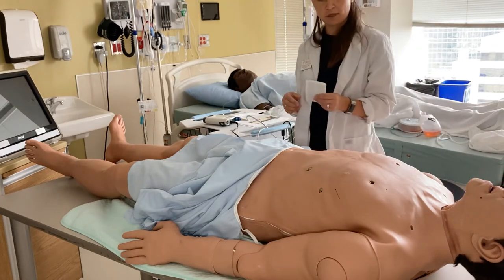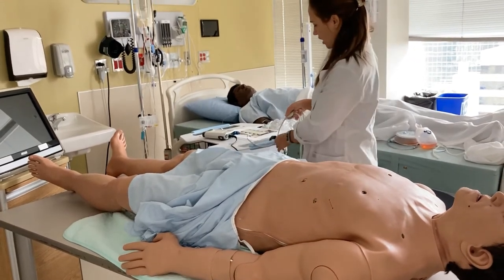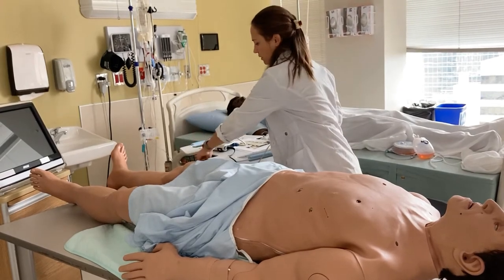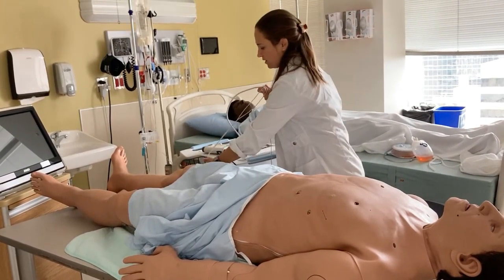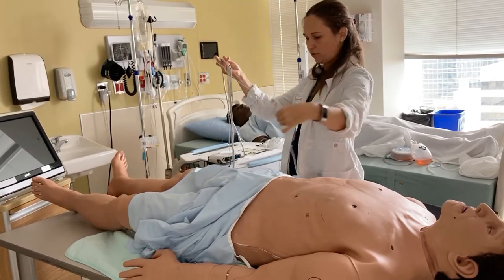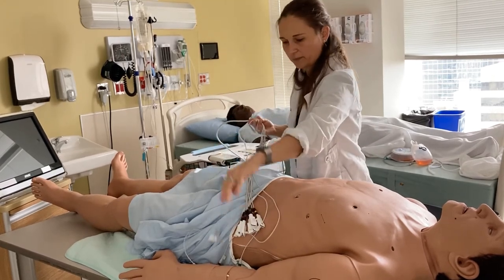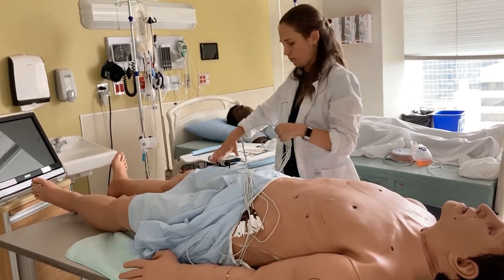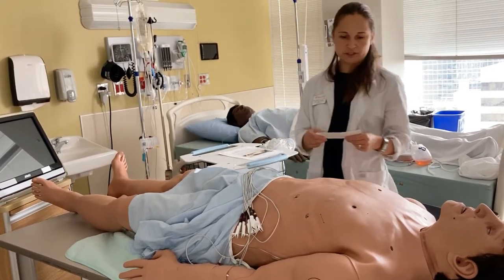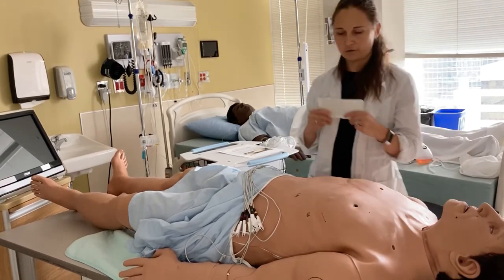What we're going to do first is make sure we're ready to do an EKG. Usually what I would do to start is untangle all my EKG wires, because no matter how many times you use them they still get tangled. These are your EKG electrodes, and I will be explaining to the patient why I'm doing this procedure while I'm getting them ready. Let's start with the placement of the stickers for the electrodes.